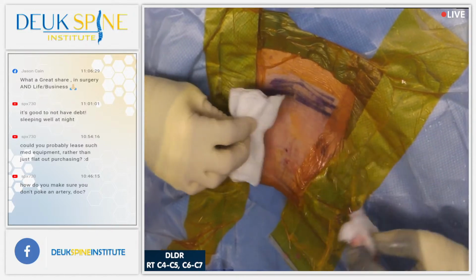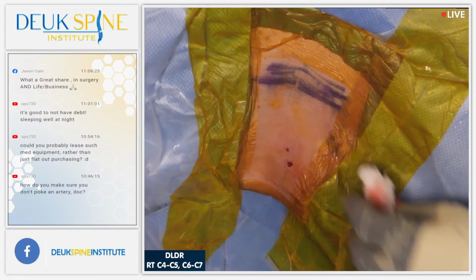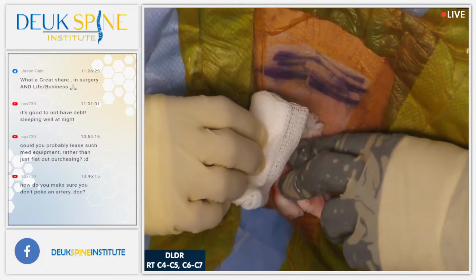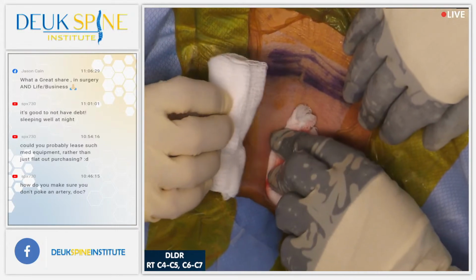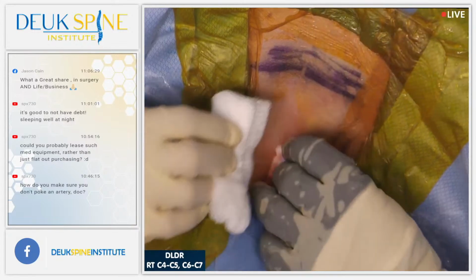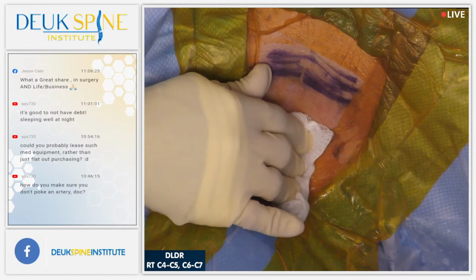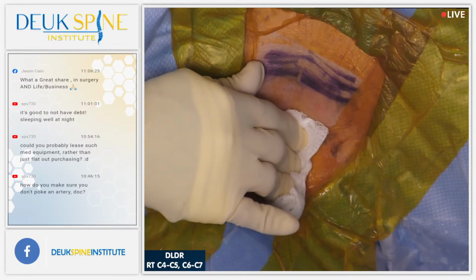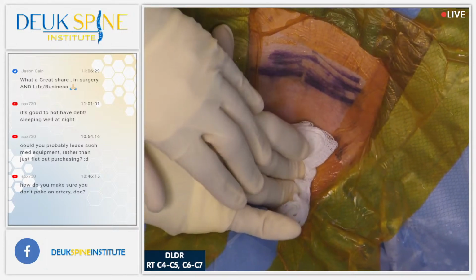Interesting. All right, let's see what we got. So there was a little venous bleeding. We held pressure. There's still a little bit. We'll hold a little pressure. And no epi was used. You might get a little more skin bleeding, but fantastic blood pressure, mean arterial pressure. But you guys see what I mean by the vampire got to him, right? So we're going to hold pressure for just another minute, a couple of minutes, and then we're going to put some steri strips on. A Band-Aid, basically. There's no suturing. There's no wound to close. It's literally a piece of tape on the skin, and that's it.